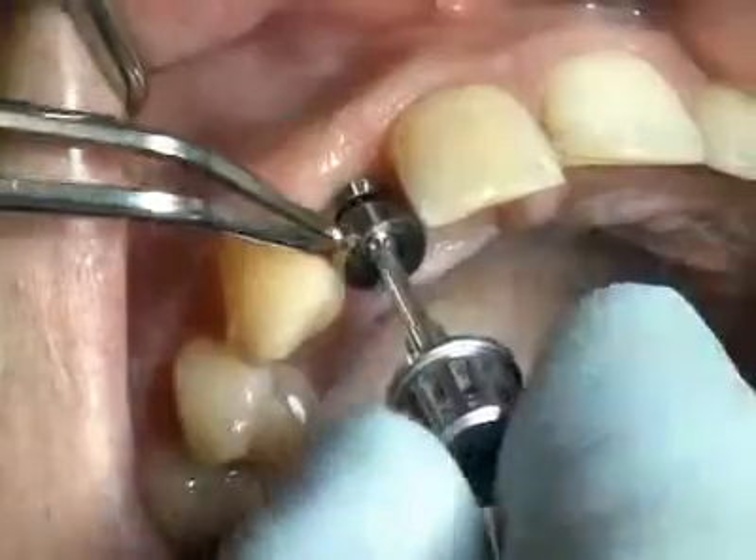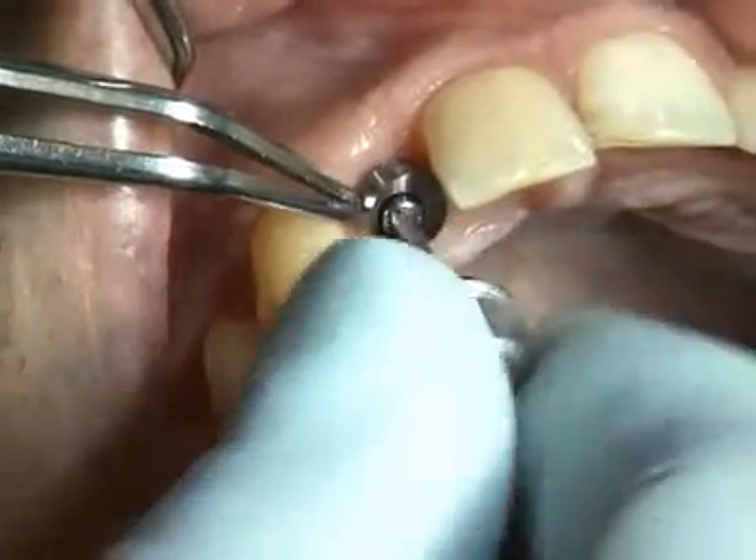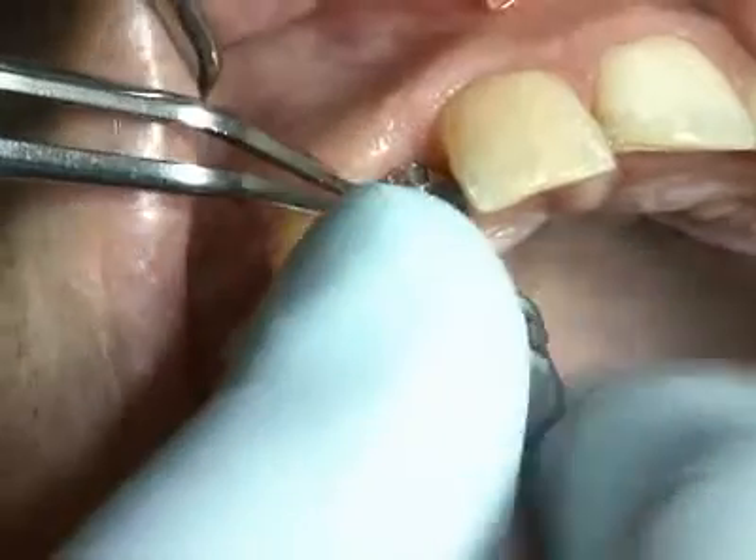The implant is now once again closed using the SES healing cap.